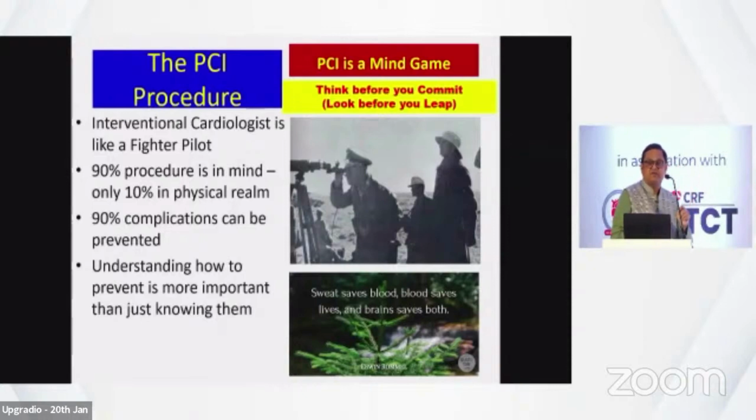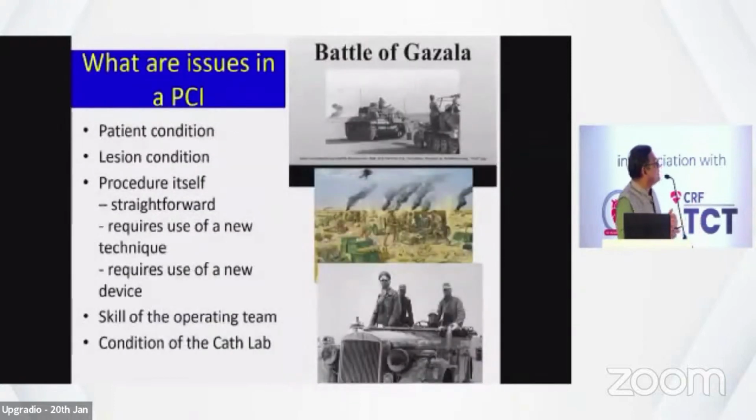But if this happens, then this is what I'm going to do. And if this happens, then this is what I'm going to do. So basically, 90% of the complications can be prevented if you already run the procedure in your mind. So I think that is important to know. Understanding how to prevent is more important than actually treating them. So that is an important thing.